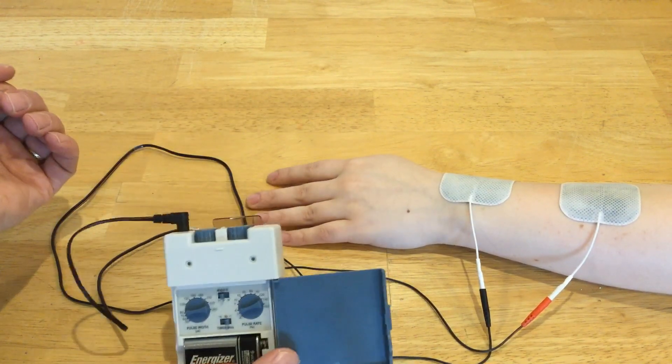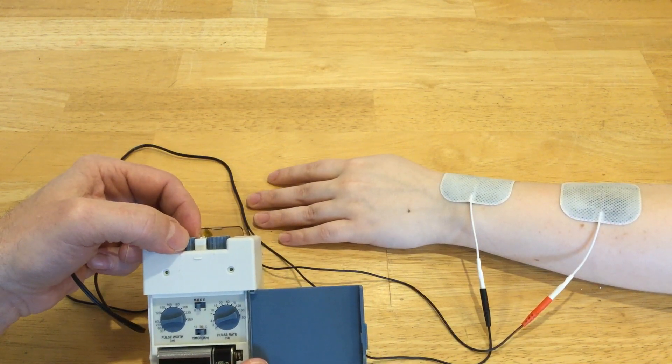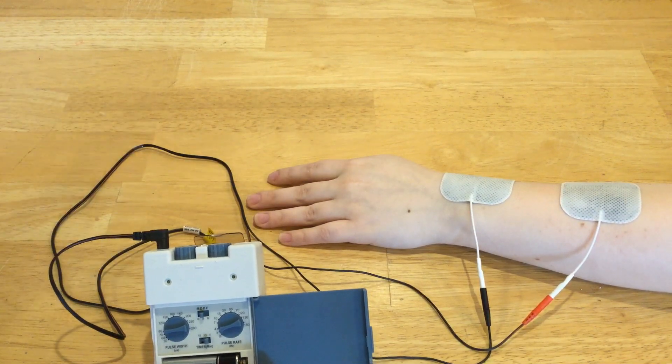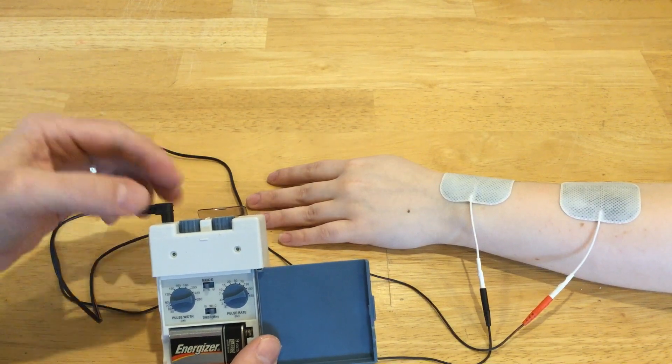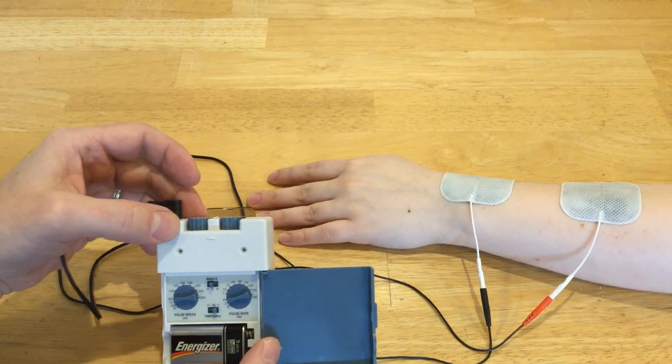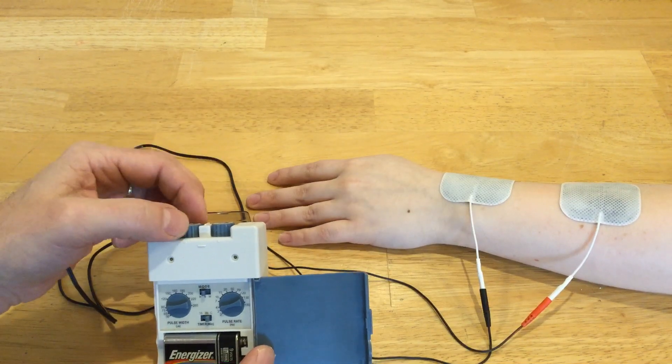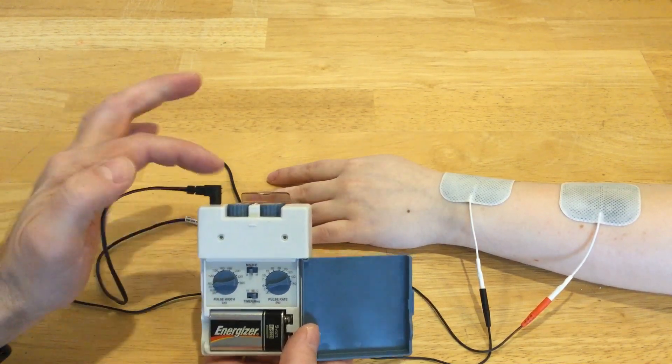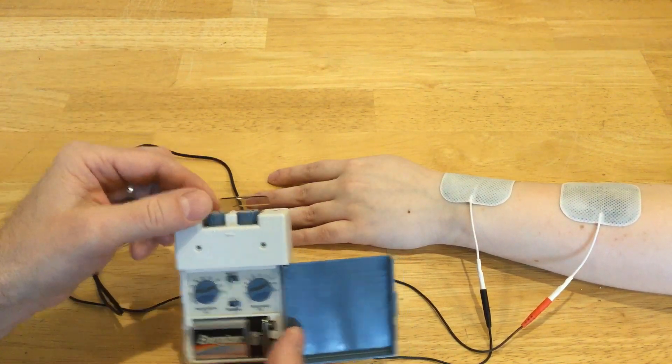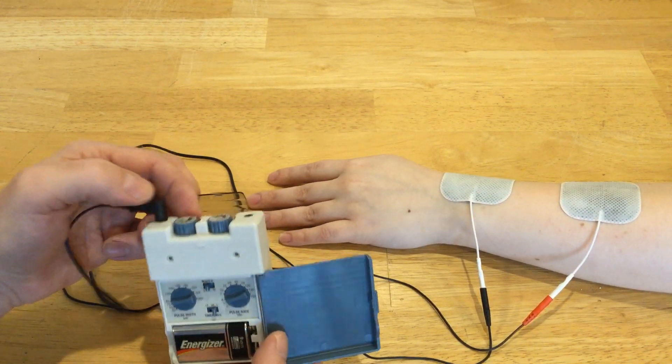Now that we are across both sensory and motor curves, I can then again decrease my intensity. Now we don't have a motor response anymore. We've backed up back across that curve between the sensory and motor curves. And what do you feel now? Just the pulse and tingly. And so now my client just feels the pulsing, that little kind of tingly pulsing, but no motor response. So you can see that with either pulse duration or intensity or really both, you can control which curve, sensory or motor, you're going to cross and therefore what response you're going to get.